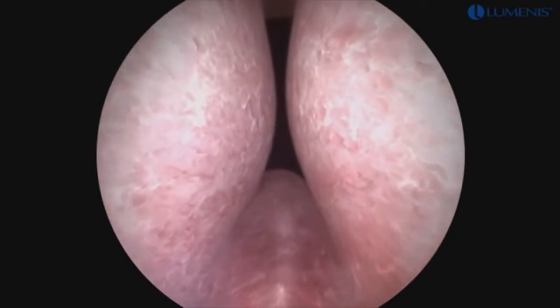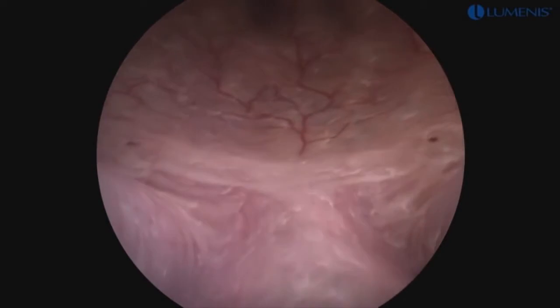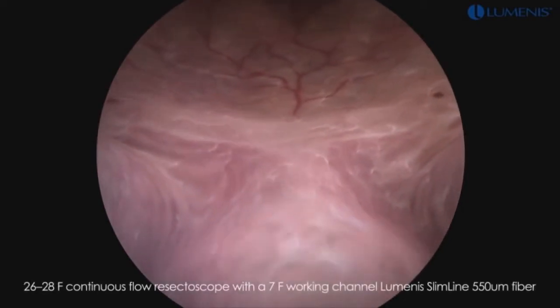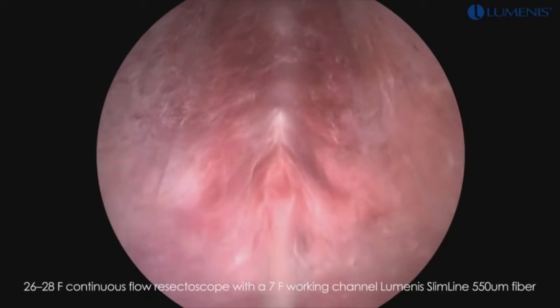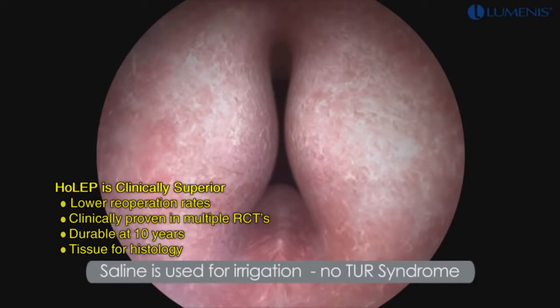Visualization of the anatomy is initially performed with the resectoscope in the bladder, locating the ureteral orifices. The resectoscope is then pulled back into the prostatic fossa to assess the extent of lobar hypertrophy and confirm the location of the verumontanum and the external sphincter. Since HoLEP is performed using saline for irrigation, there is no risk for TUR syndrome.